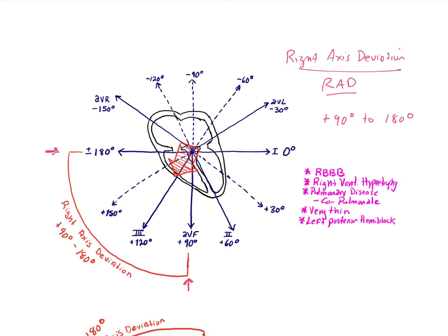Now how do you know if it's a positive or negative 180? It's just 180, so I put a plus minus there because it's just 180. Does that make sense? Just like 0, that's just the baseline there. You guys okay with that?